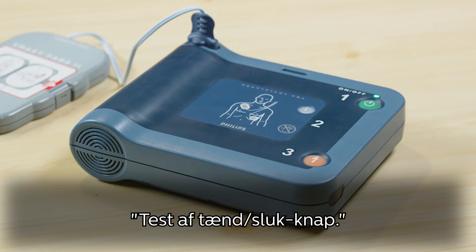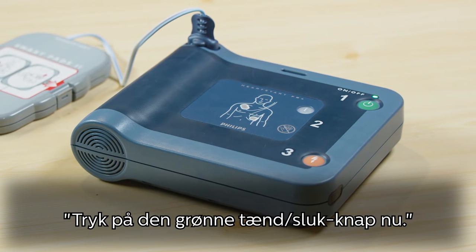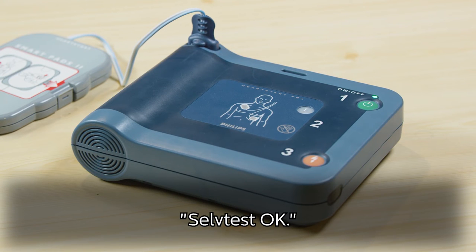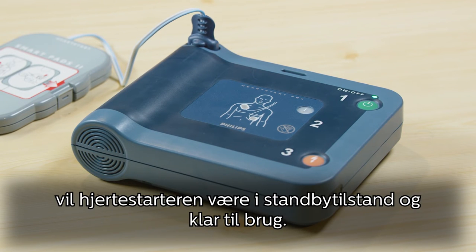The device will verbally guide you through the test, prompting you to press the green on-off button. After passing the self-test, your AED will be in standby mode and ready for use.